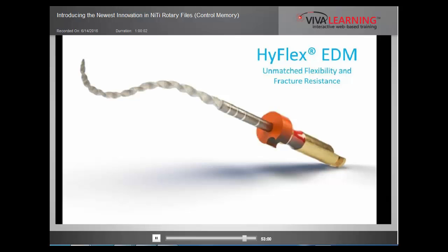Second of all, when you fit your gutta percha cone and you check for tug back, always obtain a cone shot, we call it. So a radiograph to check the fit of your cone. If you are long, once you fitted that cone before you've completed the case, cut the tip and adjust and make sure you are comfortable with the fit of the gutta percha. Let's see, there were other questions here that I need to get to.